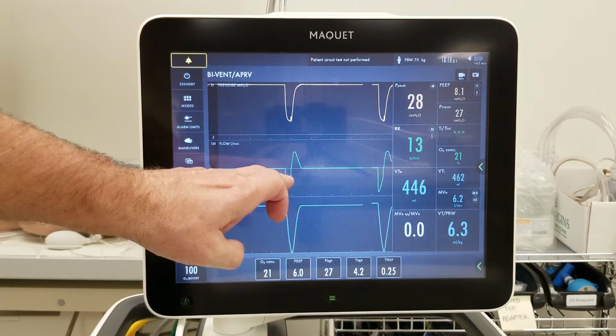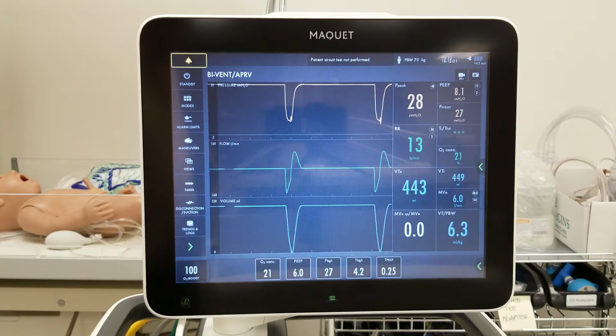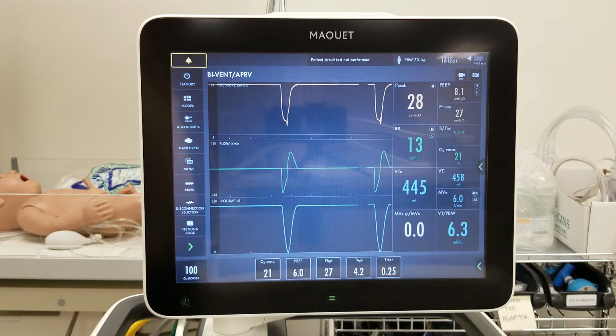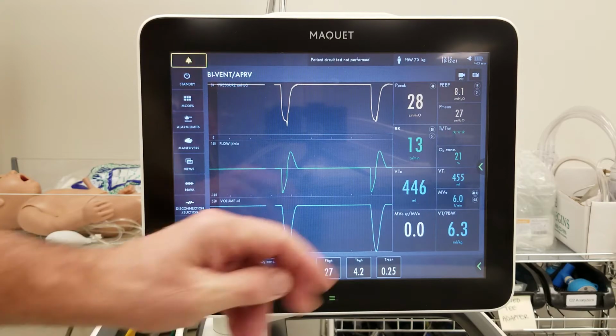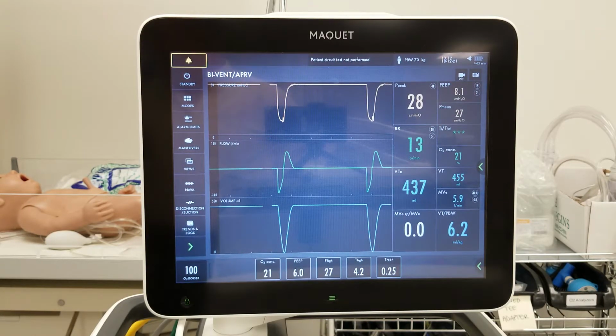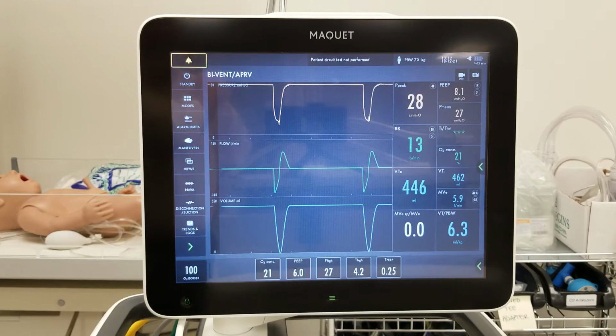You can see we are probably about 60% for our peak expiratory flow, but we didn't have sufficient expired volume, and so we needed to play a little more to attain it. And so we made the changes we did, and I walked you through them, so I'm not going to belabor them. But now we are in the ballpark of what we want to do, and how we would make those adjustments.